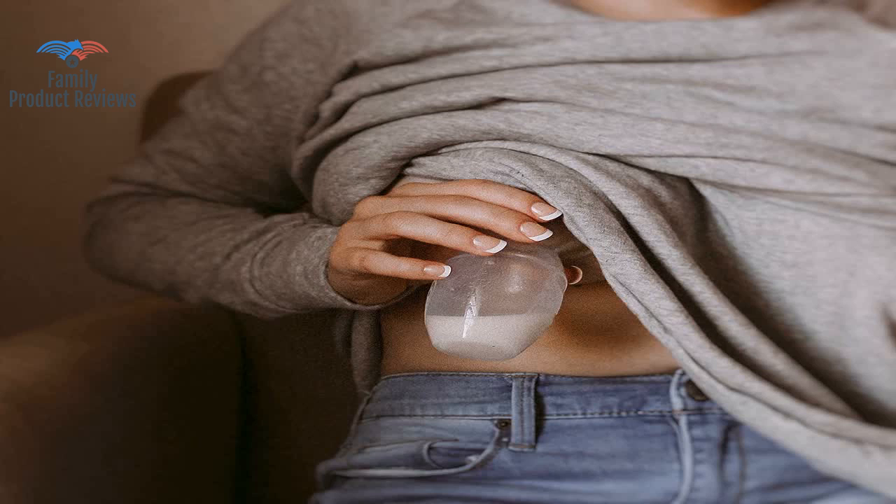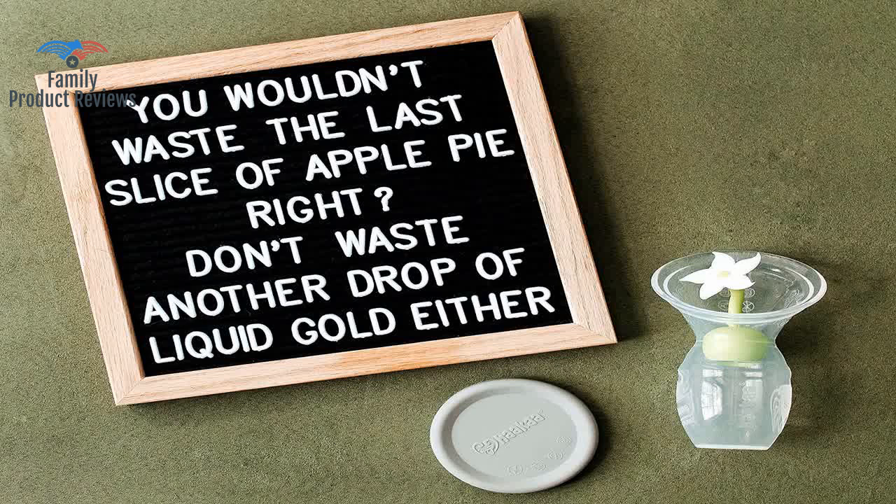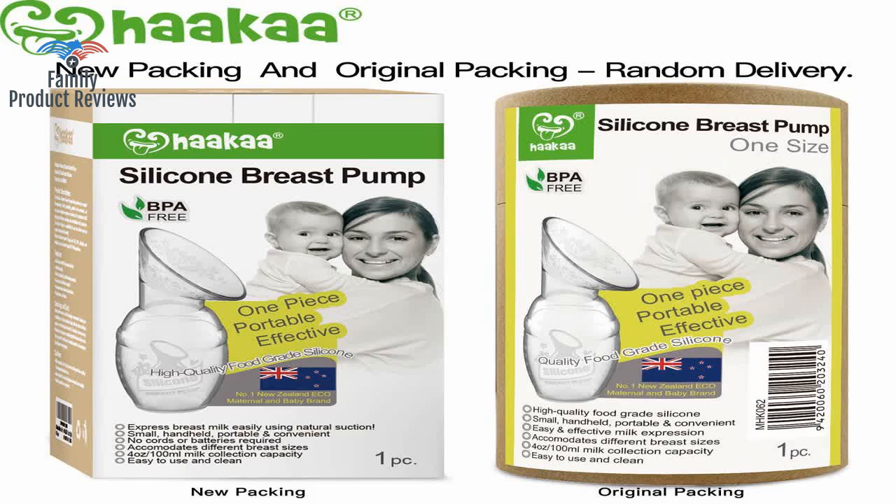Latch the baby on one breast and immediately put this silicone pump on the other breast. Long story short, this has saved me and made feedings — especially night feedings — so much easier.